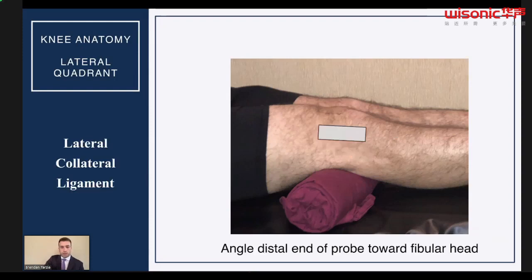If you're following a systematic approach to the knee, which I definitely recommend that you do when you're doing these ultrasounds, just get in the habit of doing it one way, and then follow that the entire way. You can always, if a person has pathology in just the lateral aspect, take a look at that. But if you're doing a full evaluation of the knee, really have a systematic approach to doing it.